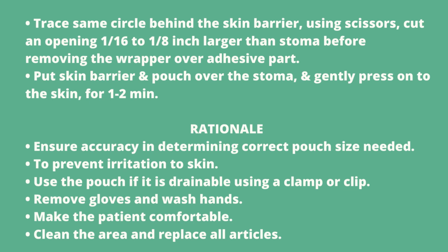Okay, so ensure accuracy, determine correct pouch size needed. Okay, that is also important. And to prevent irritations to the skin. Okay, there is some irritation, obviously there is a stoma, it means there is some irritation. So we need to prevent that irritation. Use the pouch, if it is drainable, using a clamp or clip also.